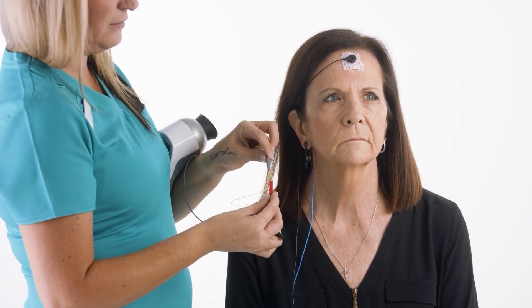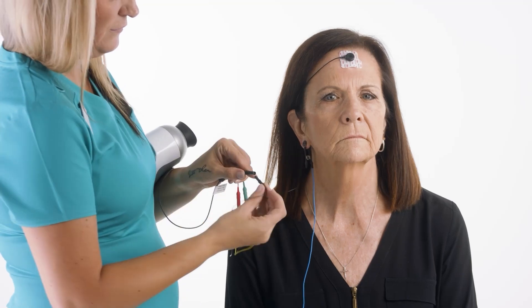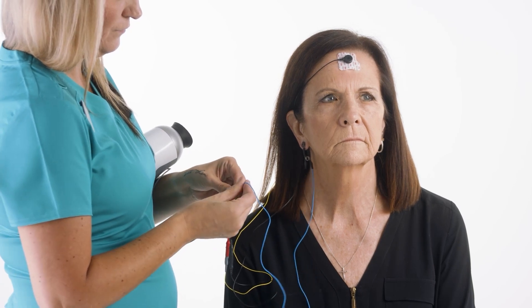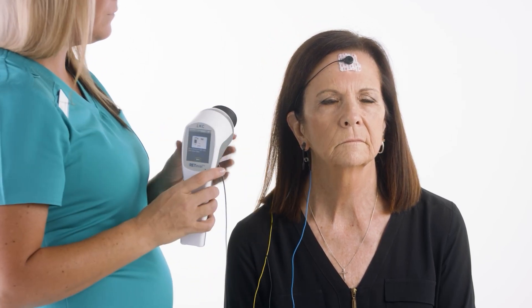The back of the head, or the recording electrode, gets connected to the red cable. The forehead patch, or the reference electrode, you'll want to attach to the black cable. Finally, the ground or the common electrode, which is the ear clip, should be attached to the green cable.